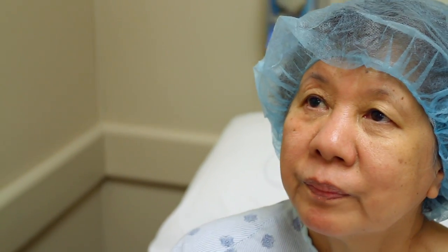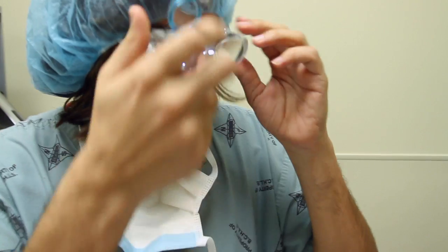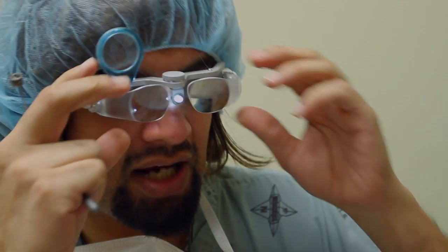We'll see in the OR, but I have now marked the axis at 65 degrees. We've provided the point of centration, and we can now assign a lens and provide it the right axis — all with one step.